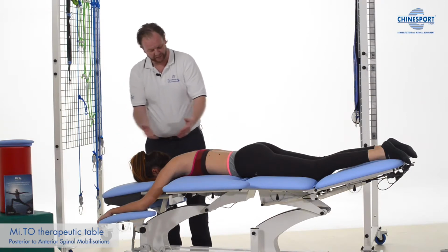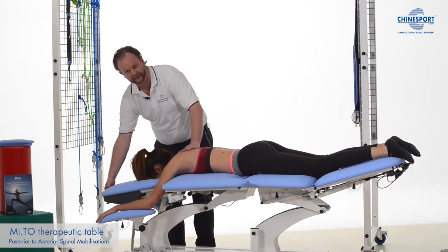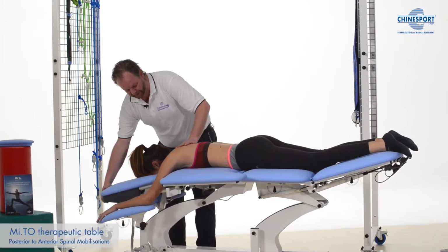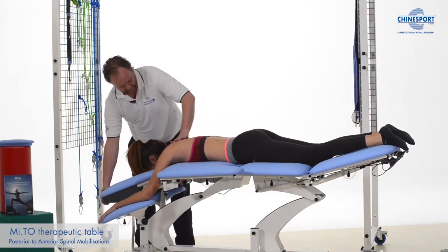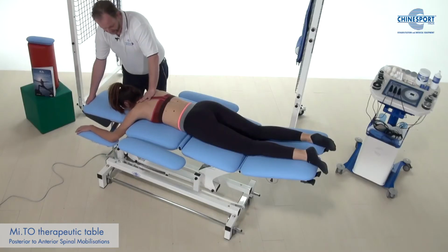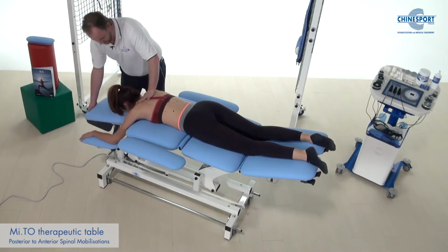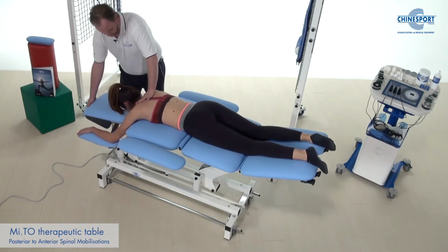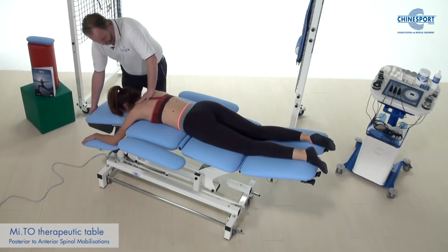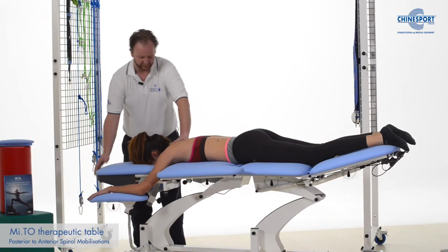If she moves a little bit more down the table, we can also focus on the neck a little bit more. I have to move up to save my back. And here we are looking a little bit higher. And we're going into a gentle flexion and extension movement, which can be very helpful also for people with disc problems. And we can also add some rotation.